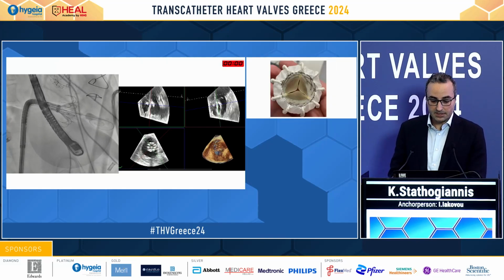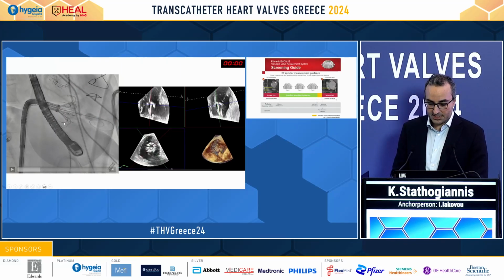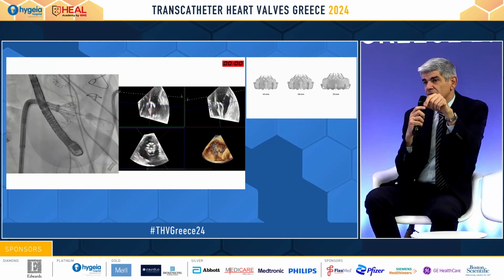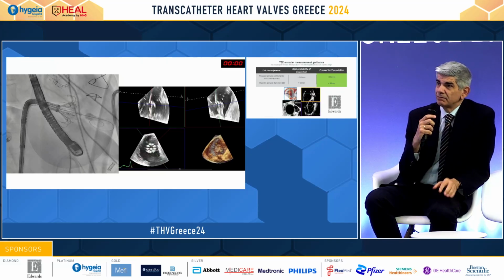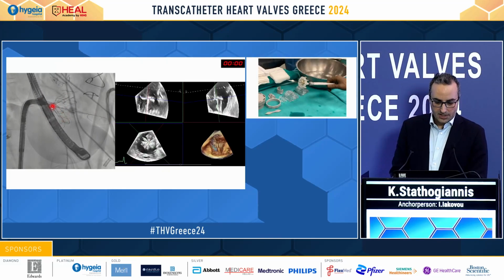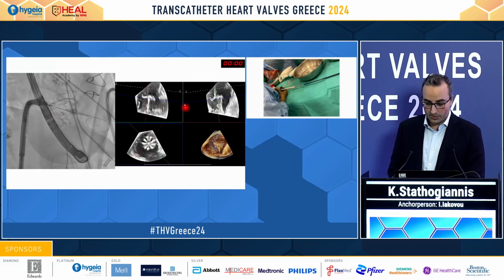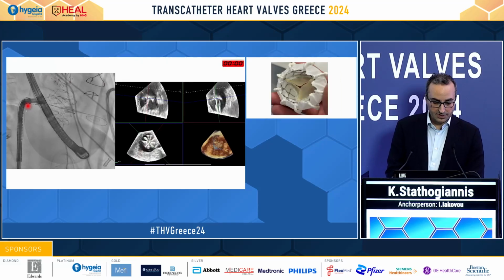And now we're starting to release the ventricular side of the valve. And we can see the images from the TE that is actually driving us. At this point, we've also, before, looked at all the anchors to make sure that the leaflets are sitting above the anchors, so we're not pinning any leaflets outside. So it's a very deliberate process to make sure we see all the anchors. And we always get to see here where we are. After we've finished with the ventricular release, we're going to the atrial release, and you can barely see here, the valve is almost ready to be released. And of course, we always keep an eye on what the TE shows us. And you can see now the valve is fully released.